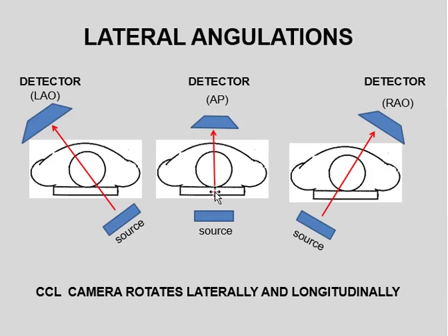We start off in the AP, as I've said before. A patient lies on the table. You have an X-ray source below the patient. X-rays go through the patient and are picked up by a detector or an image intensifier or a camera, whatever term appeals to you most. And this is the AP, anterior-posterior projection from the cardiologist's point of view.